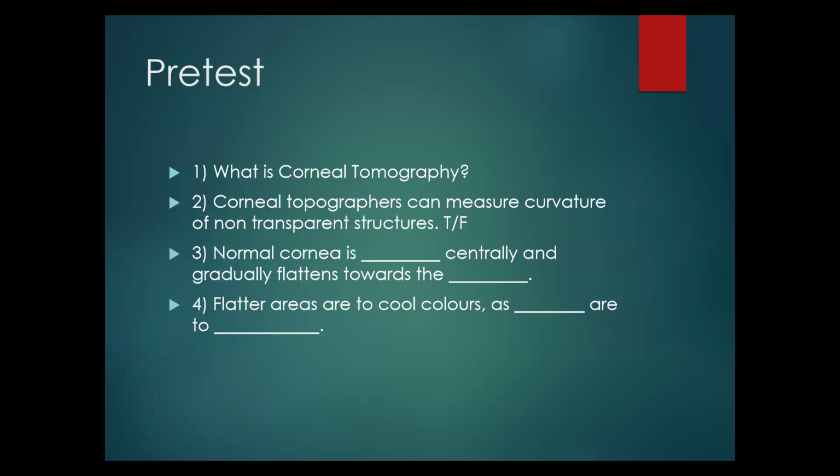I have a question, Dr. Osazee. Do you think the CTS covers both corneal topography and tomography? I know that OCT covers corneal tomography, but some other CTS maps I've seen are essentially topographic maps. So why do you think tomography is part of it? And which other CTS covers that apart from the OCT specifically?